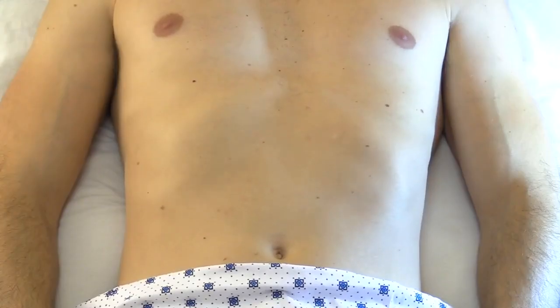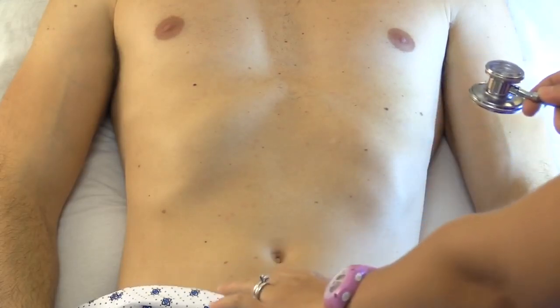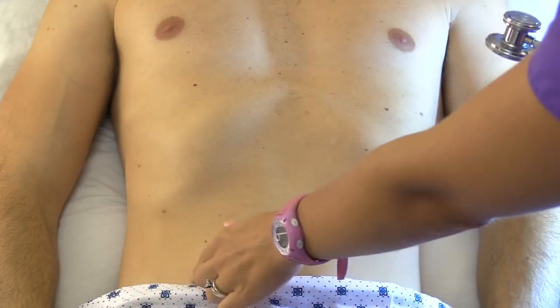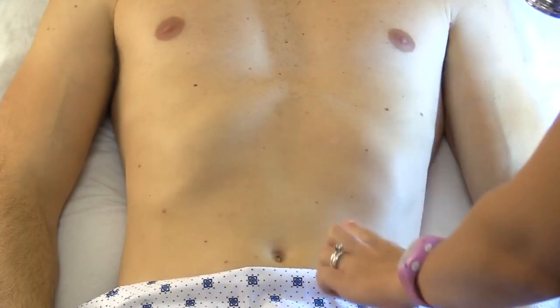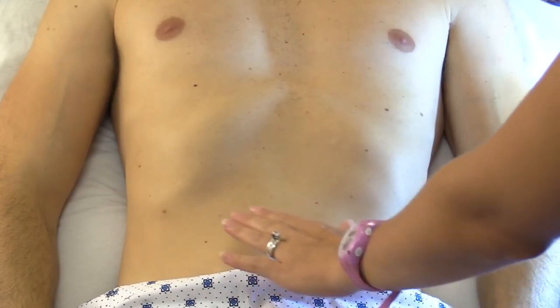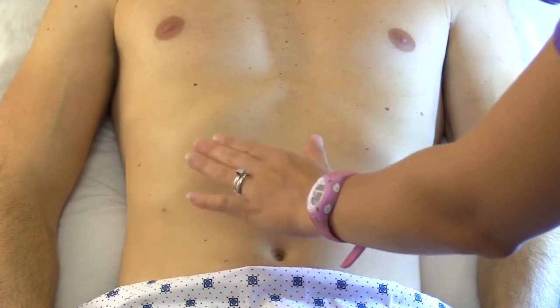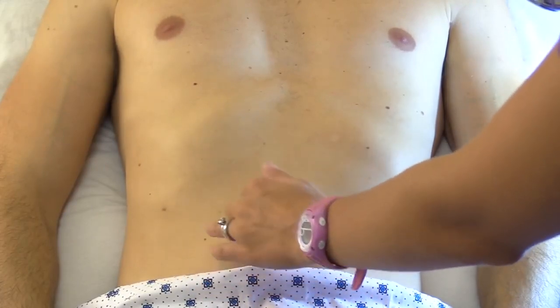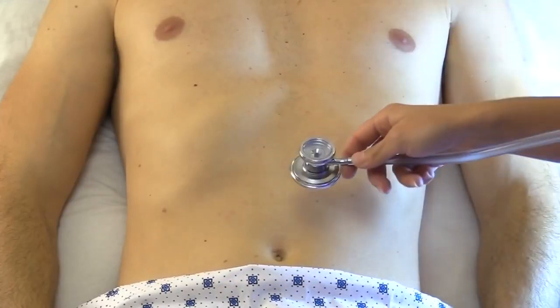So now we're ready to listen to the bowel sounds. We're going to listen with the diaphragm of our stethoscope, and we are going to start in the right lower quadrant and work our way clockwise. We're going to listen to all 4 quadrants, and you should hear 5 to 30 sounds per minute. And if you don't hear any bowel sounds, you need to listen for 5 full minutes. And you need to note, are these normal, are they hyperactive, or hypoactive? So let's listen.